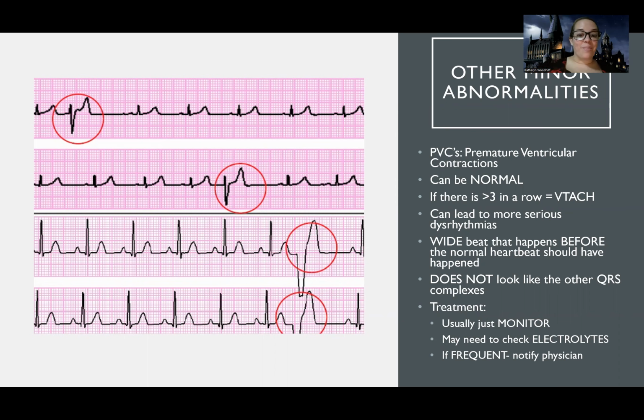So this brings us back. Remember that fun long talk I had about QT interval, and we don't want anything to land on the toilet. This is what lands on the toilet, these PVCs. They're premature contractions where the heart's getting excited. It's trying to flush that toilet early. But here's the thing. You may think, what's the big deal? It's just an extra beat. One, it's going on during that toilet time, so I can end up going into VTAC. Two, it's not a good full flush.